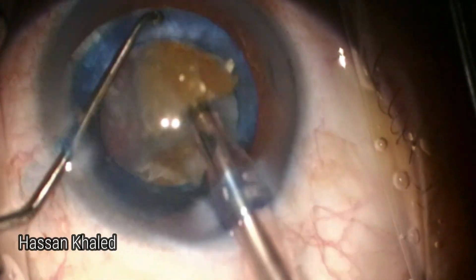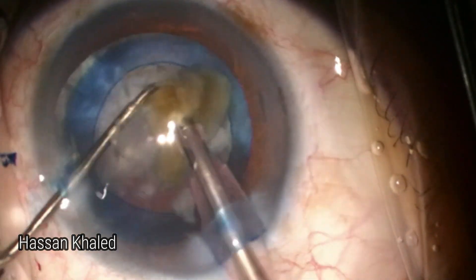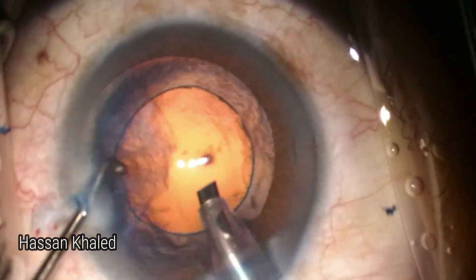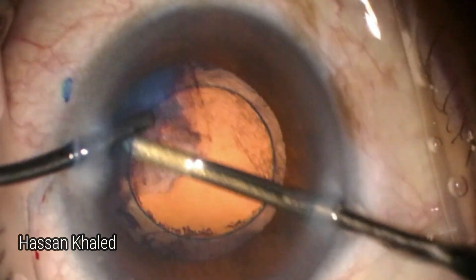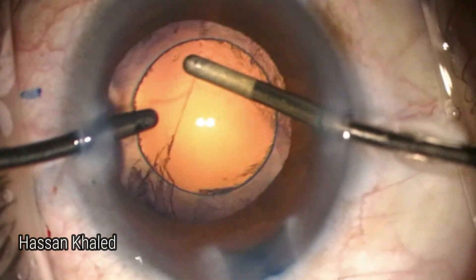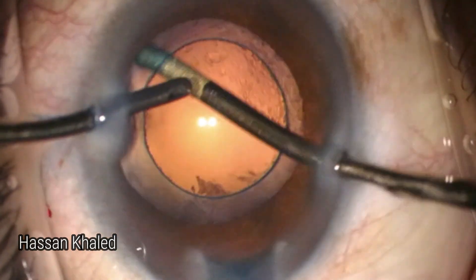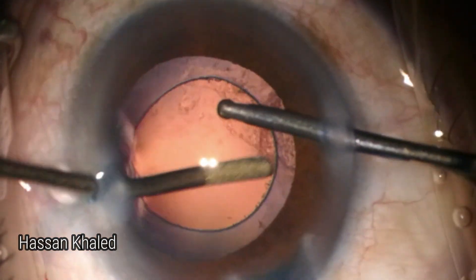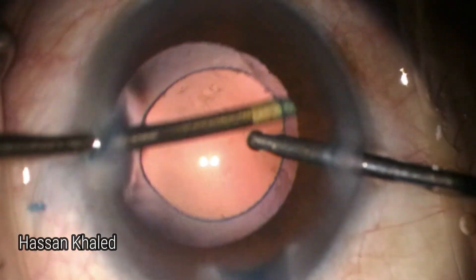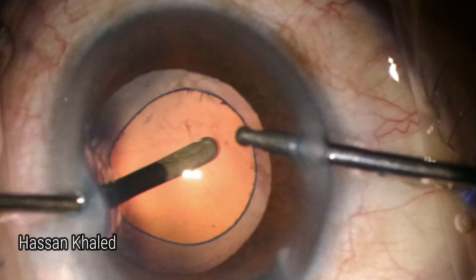Then shifting to bimanual irrigation-aspiration, using the irrigating handpiece through the paracentesis to wash and clean the cortex matter. You can see where the aspiration probe is introduced to hold and aspirate the cortex. You can also do polishing of the anterior capsular rim, as well as polishing of the posterior capsule from the cortex fibers. Here is the end of the emulsification and cortex removal.